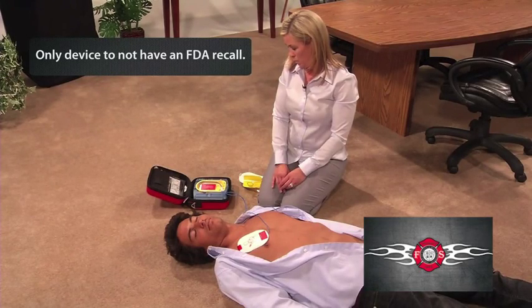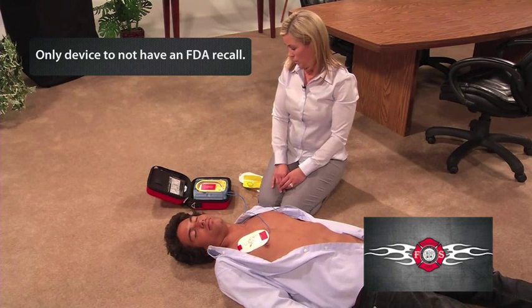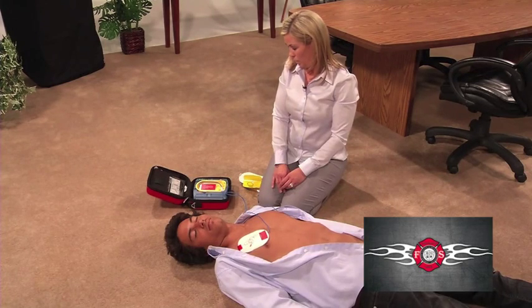Be sure emergency medical services have been called. It is safe to touch the patient — begin CPR. For help with CPR, press the flashing blue button.